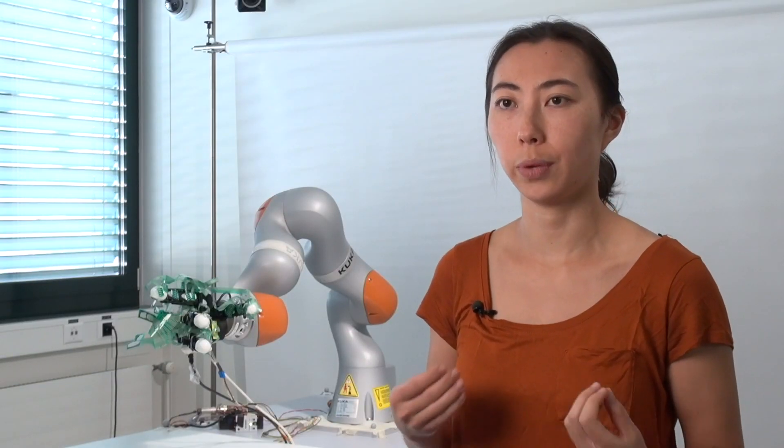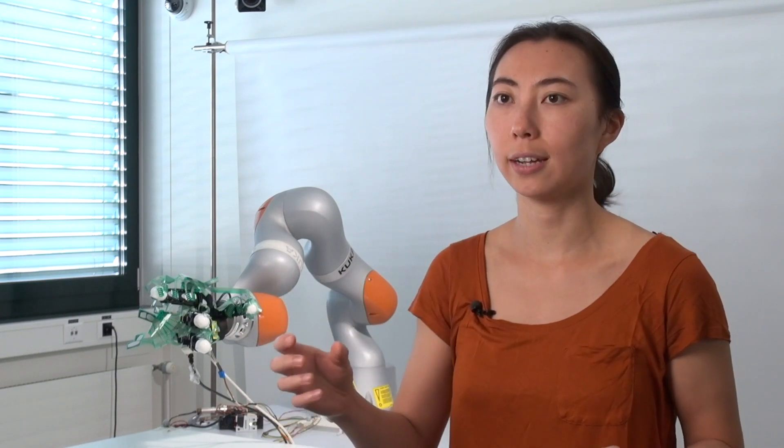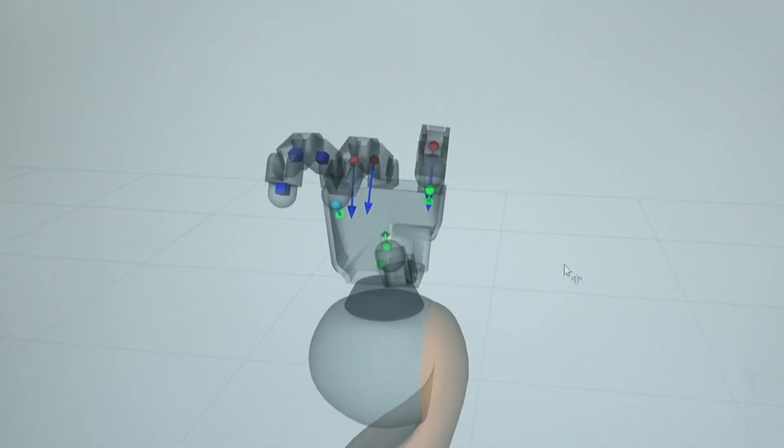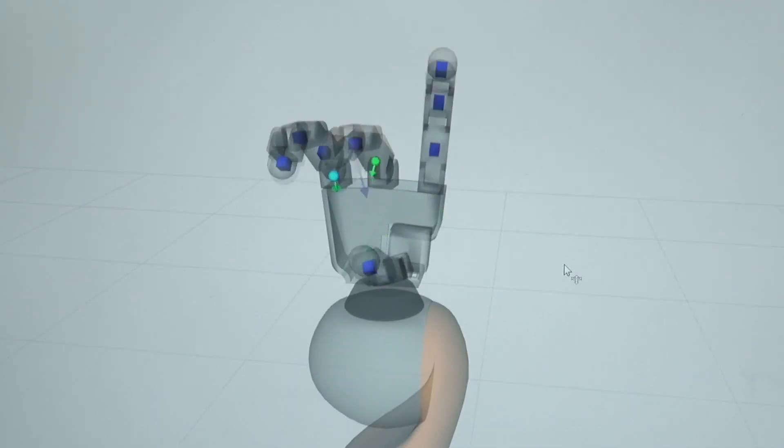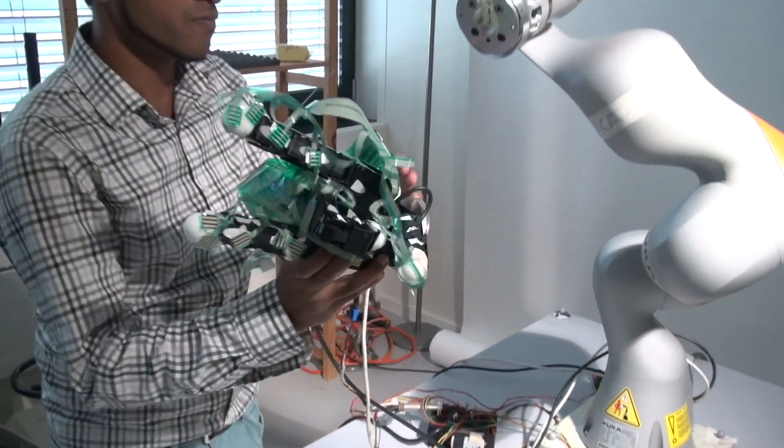This is exactly an implementation of shared control — we have user intention, essentially the finger movements, combined with robotic automation which closes the hand around an object and keeps it there so that a grasp is more robust. We designed the contribution of all of those components, primarily the algorithm — the algorithm to react very rapidly, to sense that things are slipping, and to decide how to place the fingers to react and re-stabilize the object.